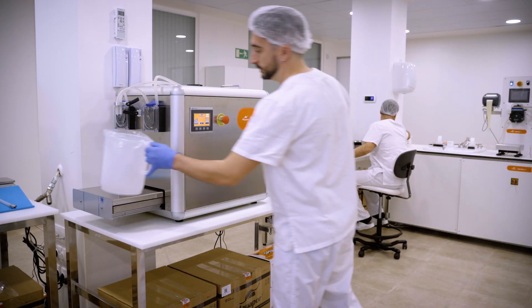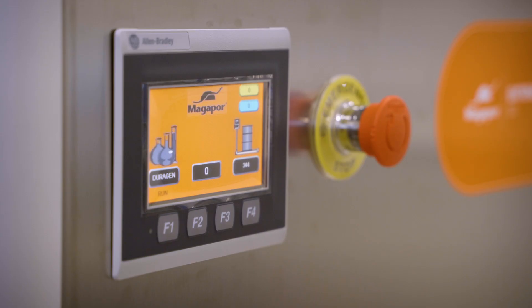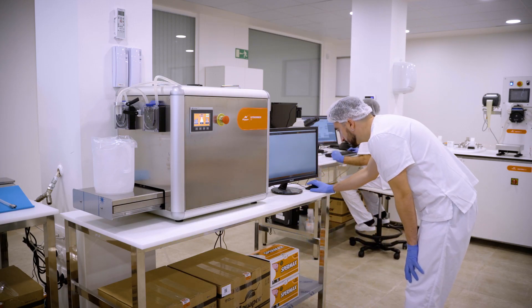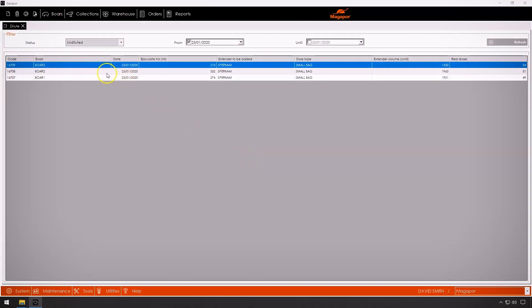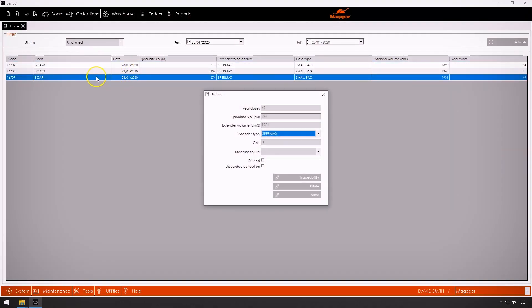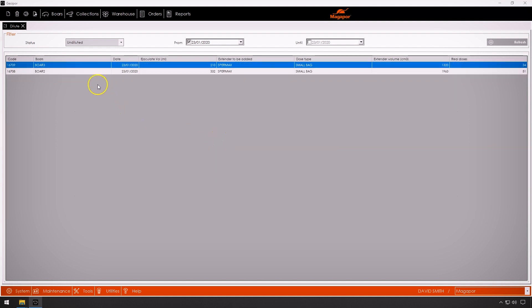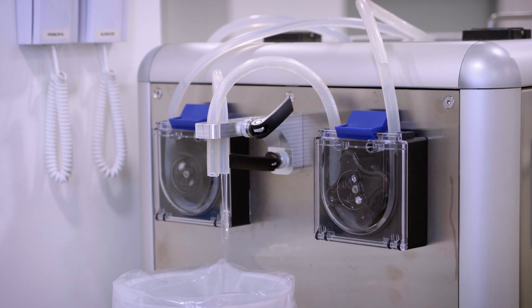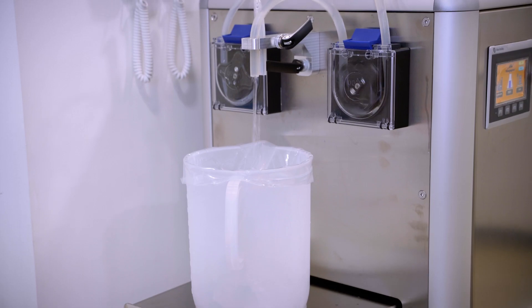For the dilution process, Magapore has the Extender Box, the equipment that dispenses the precise volume of water and extender at the desired temperature. From the dilution section of Gesipor, we see the ejaculates we have in the dilution queue or those already diluted. Once the ejaculate that we want to dilute is selected, we will proceed to the selection of the unit to send the work order, loading automatically the volume of extender.